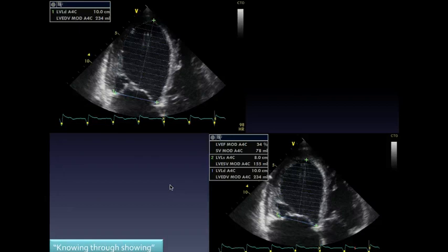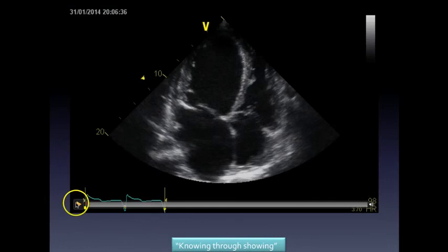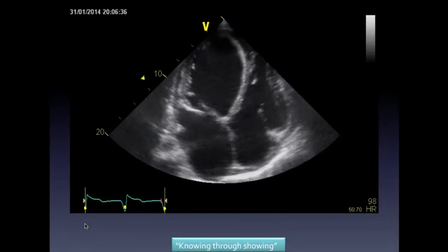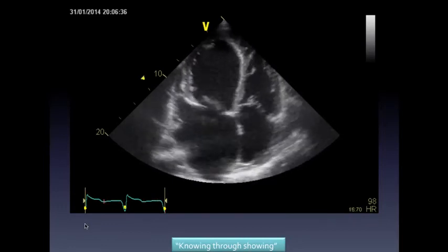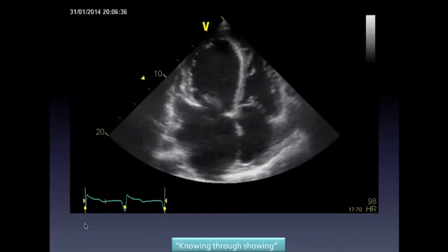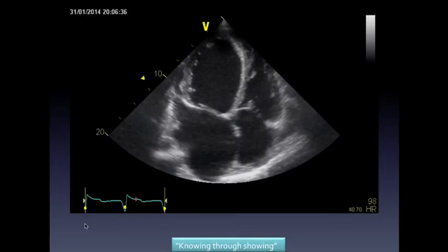And I just think that's a particularly good shot for a few reasons. Firstly, that kind of vigor you see in contractility, its movement of the heart, is not thickening. Okay? So you could be fooled into thinking that his ventricle is a little bit better than it is. Secondly, I didn't tell you if he's on an inotrope or not. You didn't ask, did you? Thirdly, the right ventricle is extremely important, and I just wrestle with the right ventricle the whole time. But you get the sense here that even the right ventricle ain't so good. The left atrium is huge. Okay? And there's something else on the next slide, I think.